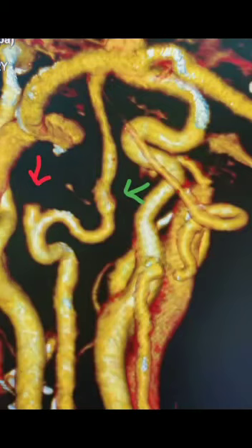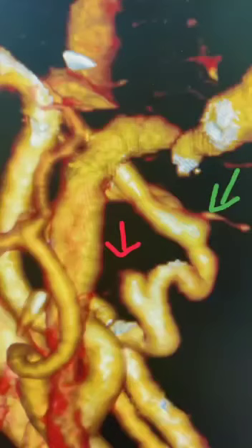The 3D reconstruction of the CT angiography clearly shows the proximal stump marked by the red arrow and the distal stump marked by the green arrow. This is an alternate view which confirms the same.